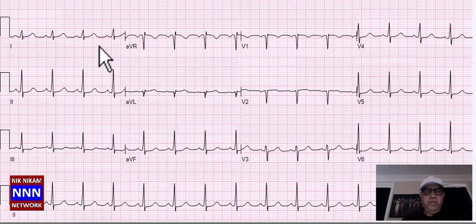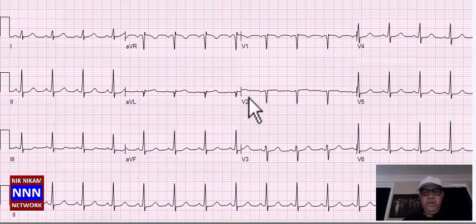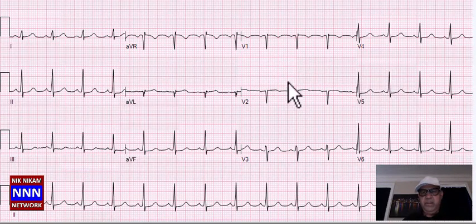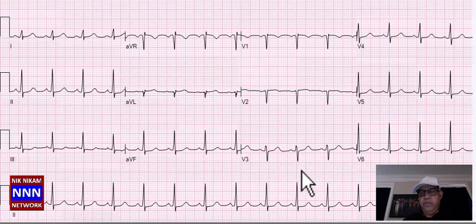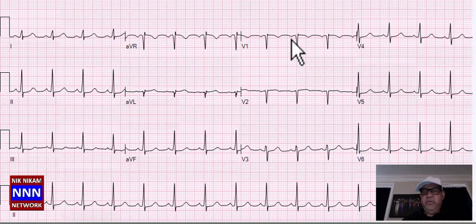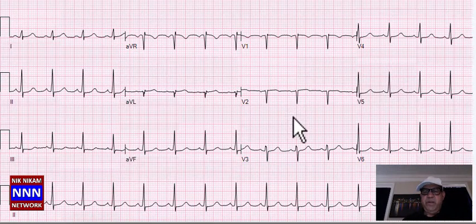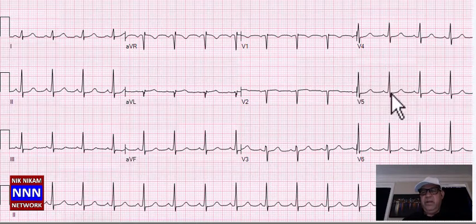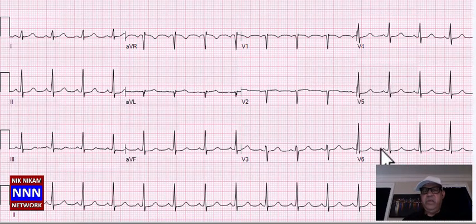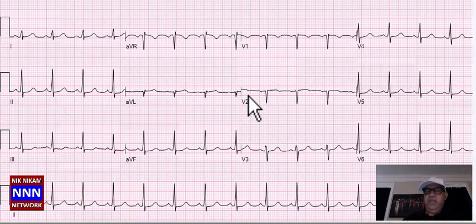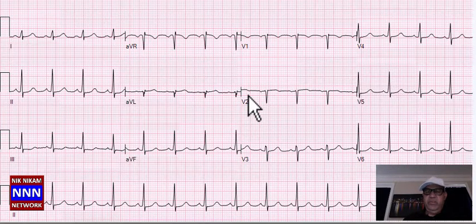We have sinus rhythm. Inferior leads look all right. Anteriorly, loss of R-waves — presence of old anteroseptal myocardial infarction. Lateral leads look okay. This is a patient with most likely a septal infarct with non-specific T-wave changes.